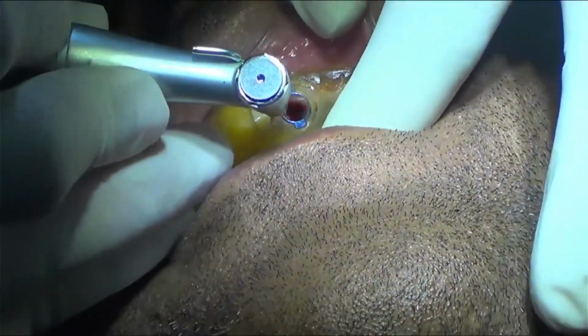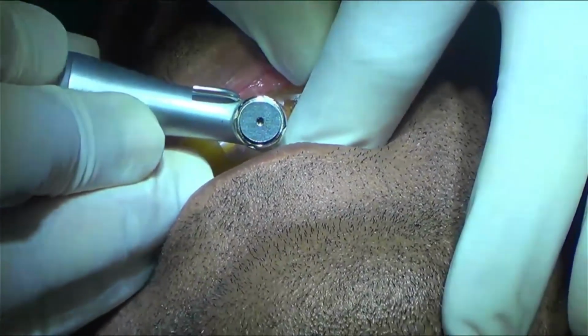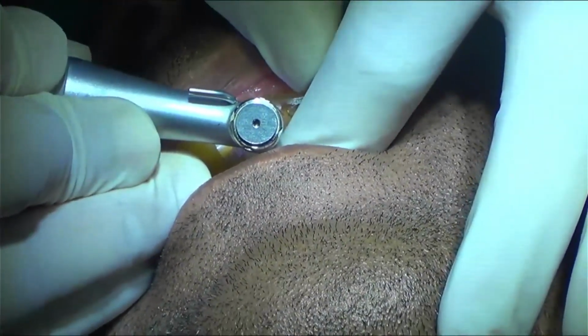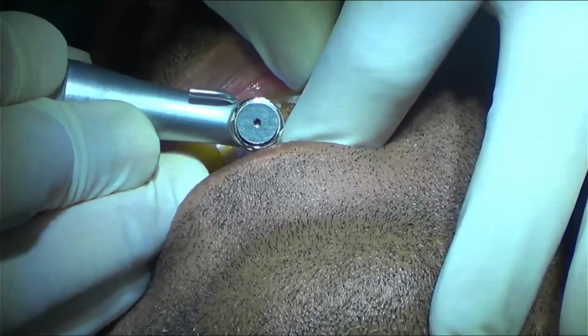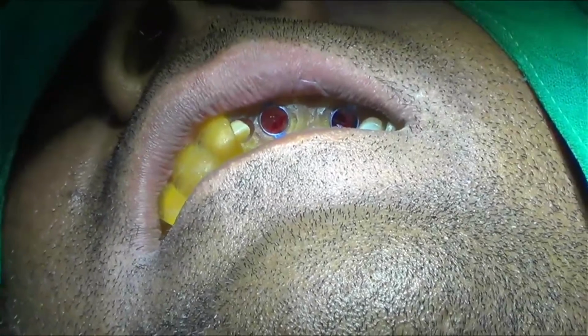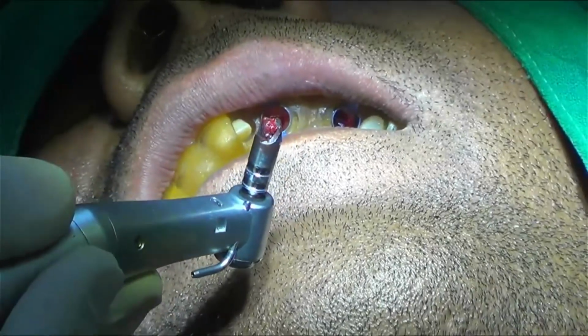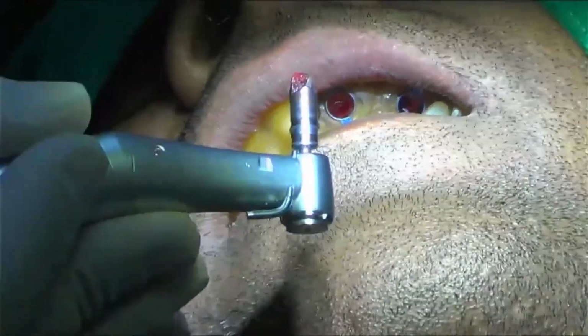So again, I am stabilizing my guide, putting it inside. Now I have done the bone flattening, but it is not going down. It means my bone chips are getting entangled in the bone flattening drill.